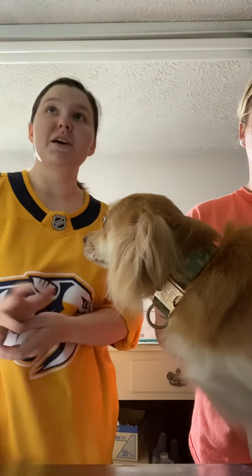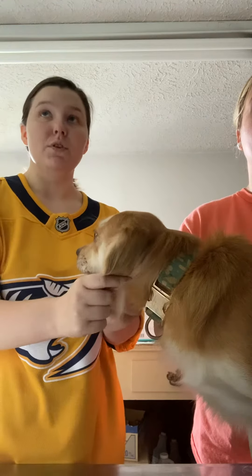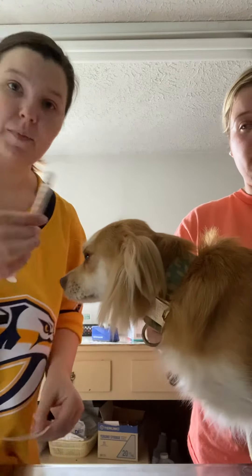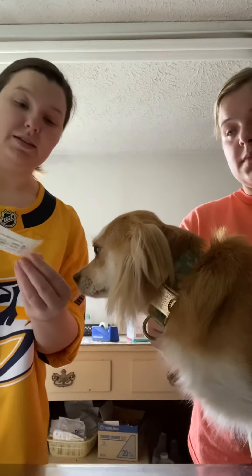Hello. I'm Shannon Edwards and I will be performing the ophthalmic administration of fluorescein stain. I've already washed my hands. I have my ophthalmic solution and my test right here.